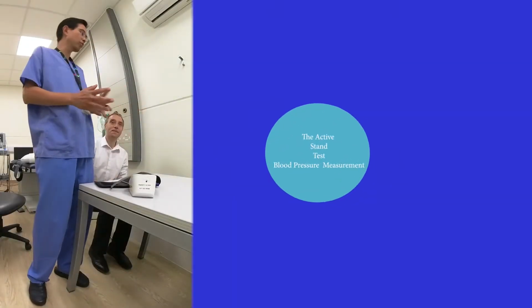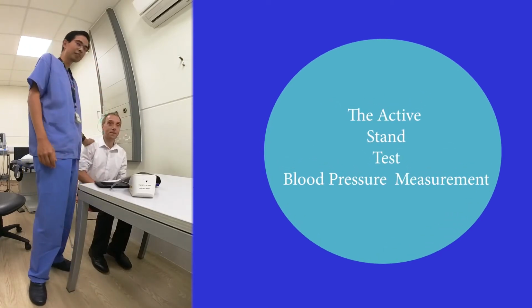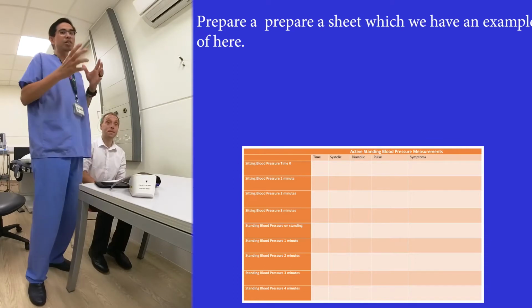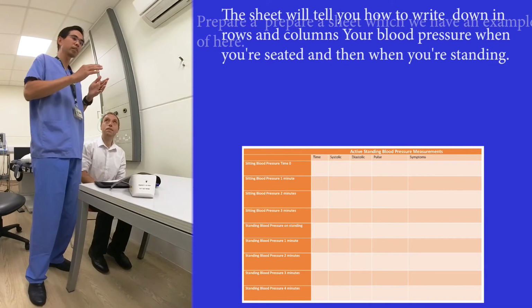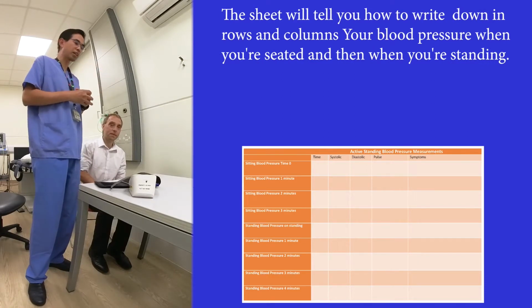Today we're going to learn how to do an active stand test. We have a nice subject who's Phil. And if you are at home doing this, what we'd like you to prepare is a sheet, which we have in the side just here. This sheet will tell you how to write in rows and columns your blood pressure when you're seated and then when you're standing. So let's demonstrate.